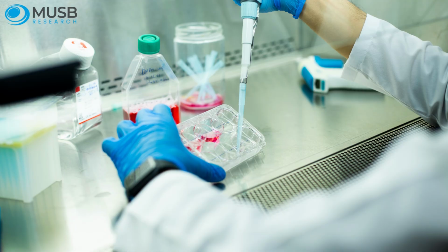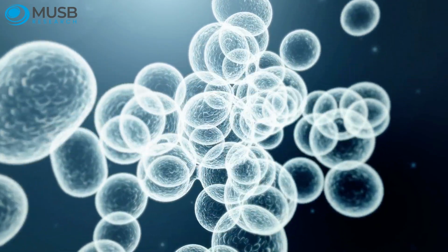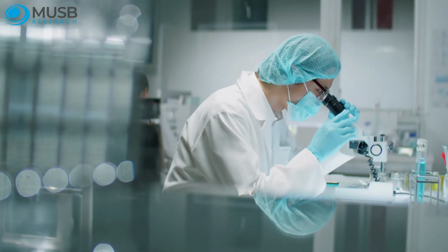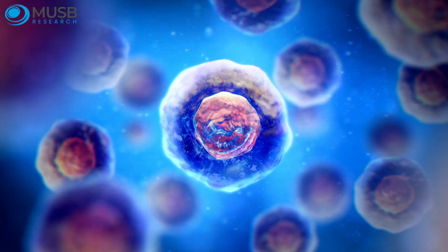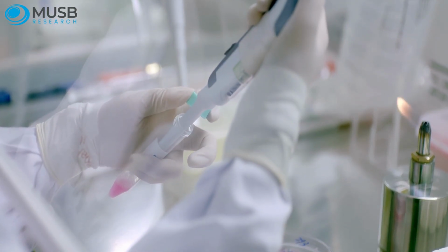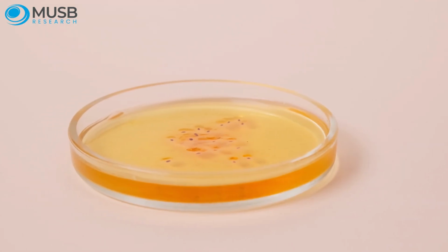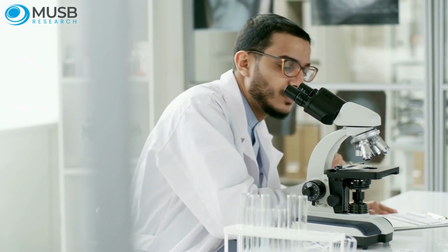Let's get started. What is cell culture? Cell culture is the process of growing cells outside their natural environment, usually in a laboratory setting, under carefully controlled conditions. These cells can come from plants, animals, or humans. Once they're isolated from tissue, they're placed in a culture flask or dish, provided with nutrients, and maintained at the right temperature and atmosphere so they can survive and grow. This allows scientists to study cellular behavior in a controlled and repeatable way.